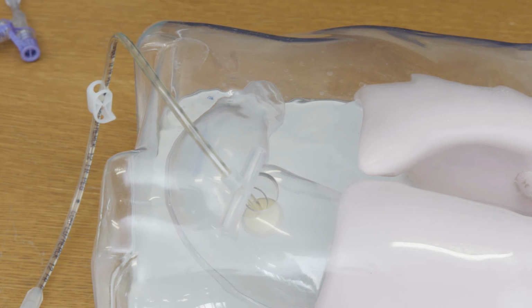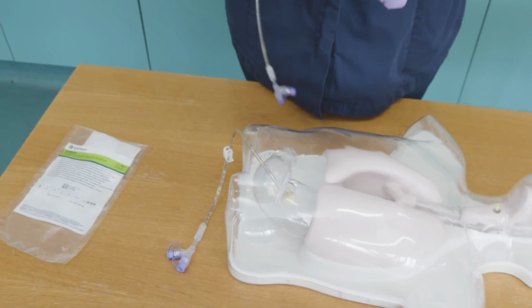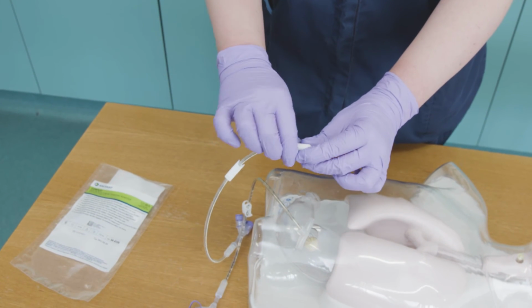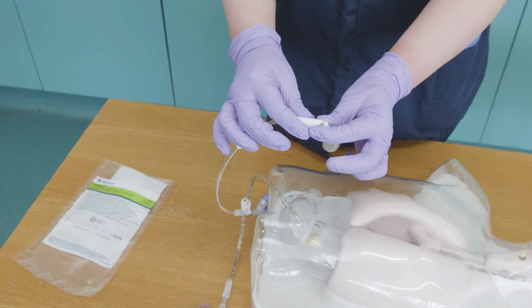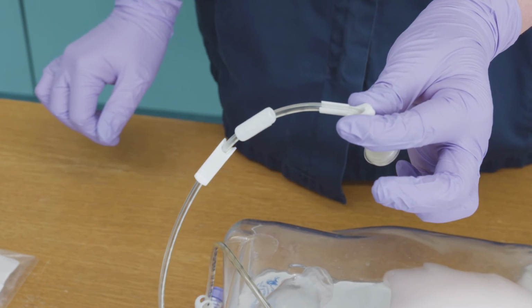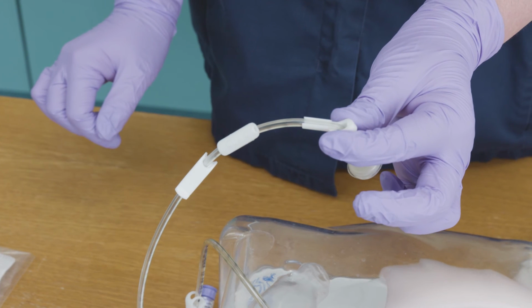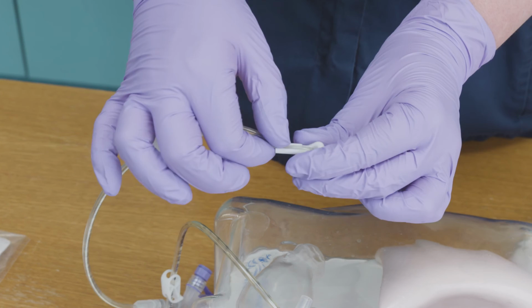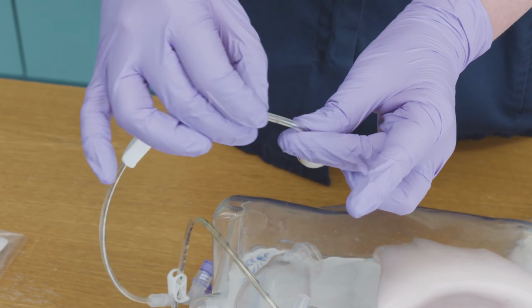To advance a Corflo PEG tube with an external fixator called a right-angled adapter, you will need to open the white plastic fixation device by holding both ends and twisting them away from each other until the two parts separate. You will then proceed to advance and rotate the tube in the same way as just shown.